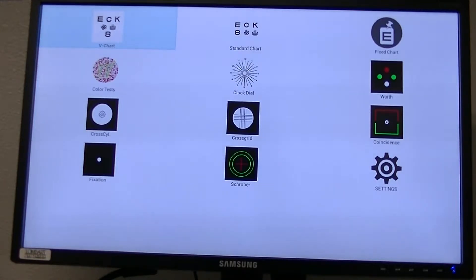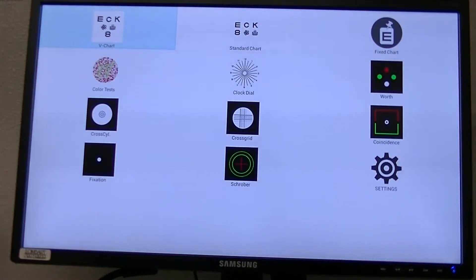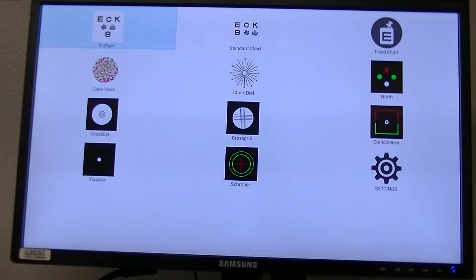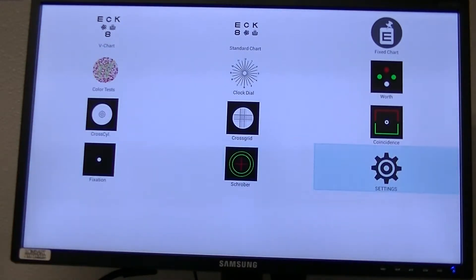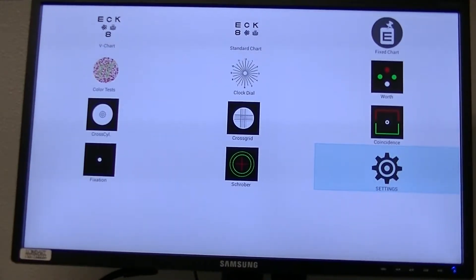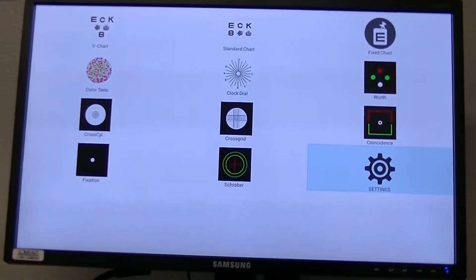Now this is where we have all the different selections and settings. We have V chart here, standard chart, fixed chart, color test, clock dial, worth four dot, cross cylinders — all these different tests are here. But in order for you to use any of these, you have to go to settings first. So we're going to go down and then go across to settings, and you can see that highlights over there in settings.